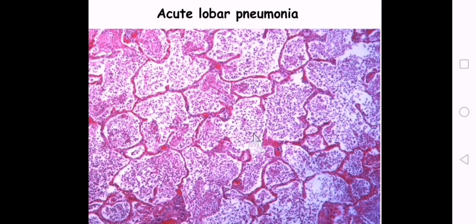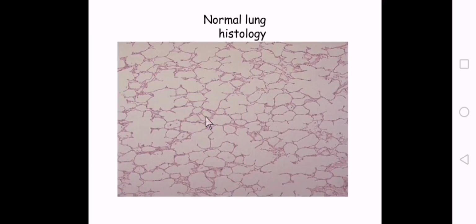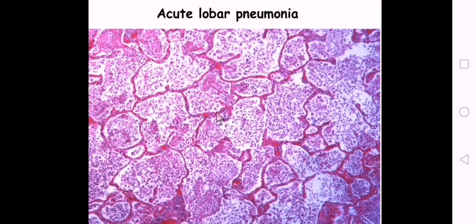فهذا الانفلاماتوري exudate fill the space اللي هو المفروض يكون مكان للهواء الداخل. فأكيد البيشنت راح يصير البرزنتيشن مالته cough and shortness of breath، لأن ماكو مكان لدخول الهواء، يعني يقل الكاباسيتي of the lung. بلس إذا تقارنون الوول مال هاي الالفيولاي يختلف أكيد اختلاف تام عن هذا الوول. فهنا الوول عندنا also thickened نتيجة الإديمة and acute inflammatory cell infiltration.